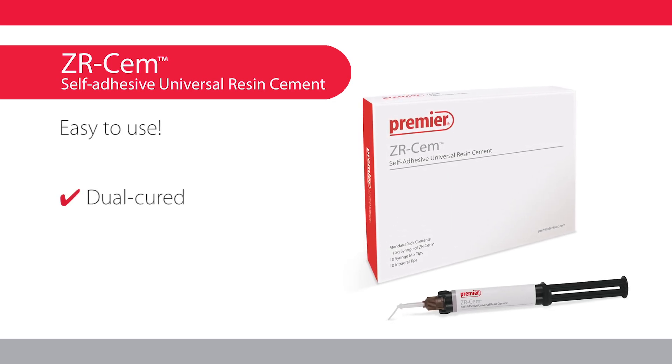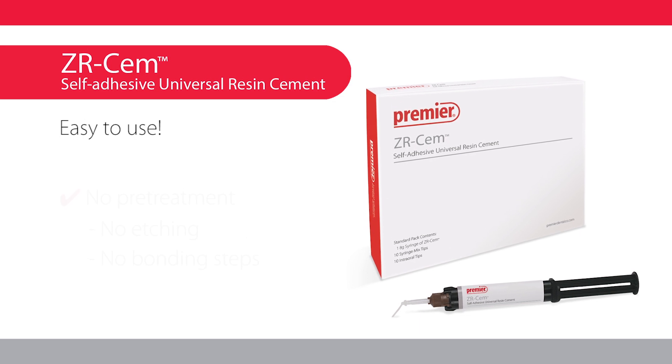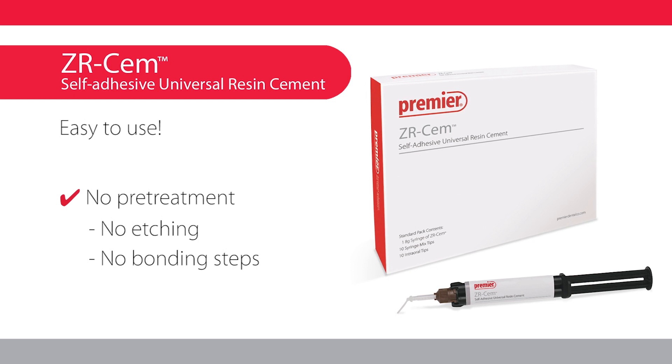Dual-cured ZRCEM is simple to use with optimal viscosity and easy handling. No etching or bonding steps are required. Just dispense the cement and seat the restoration.